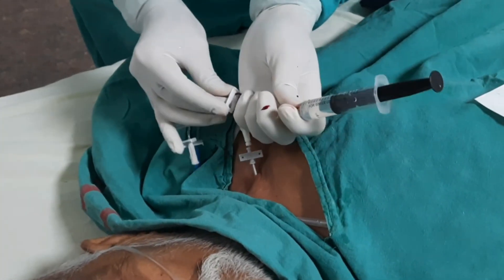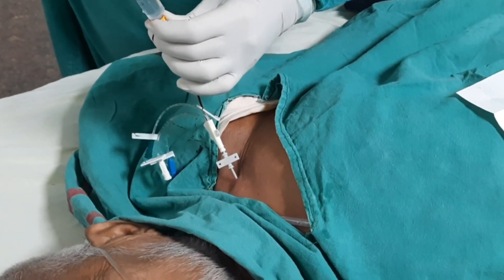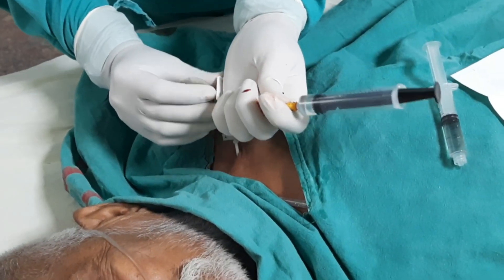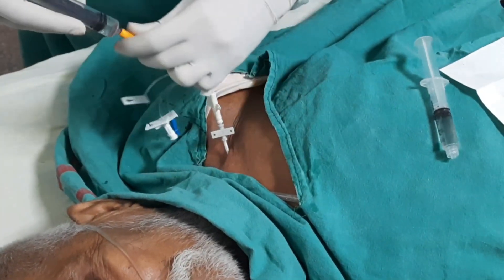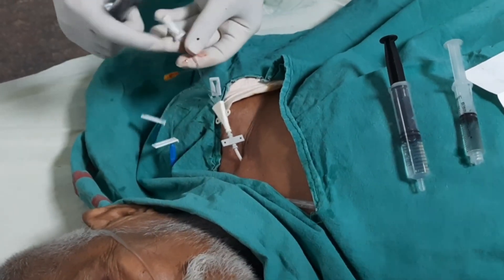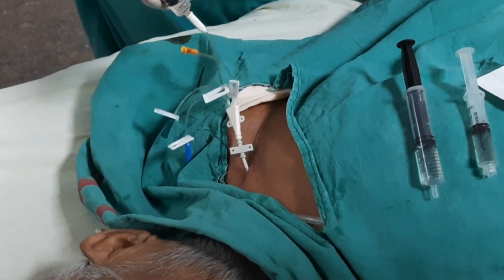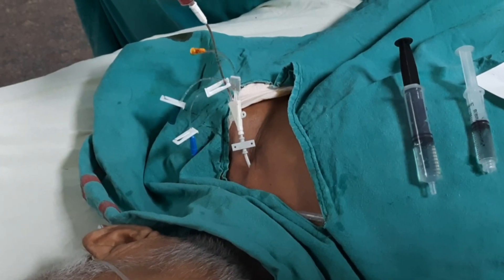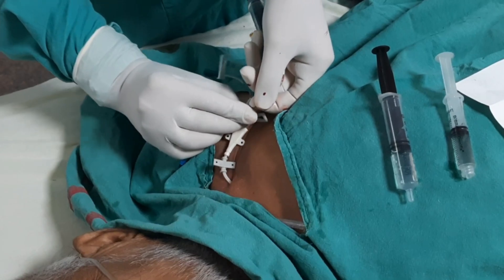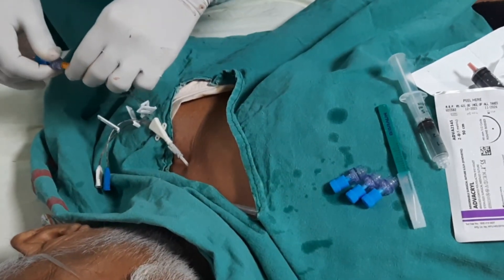After that, we will check all ports with heparinized solution. See the yellow port — blood is coming, so it is functional. We check all ports one by one. Here is the white one — blood is coming. We push heparinized solution to keep the central line patent.